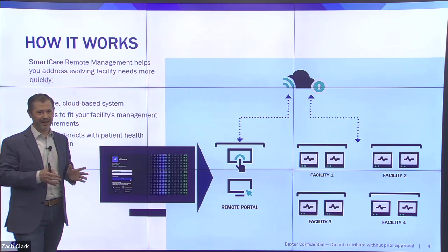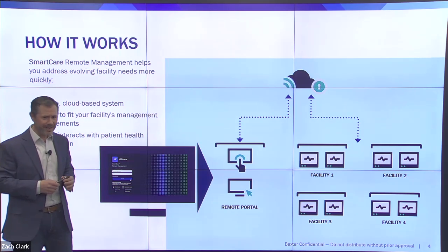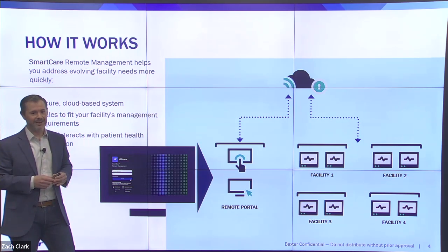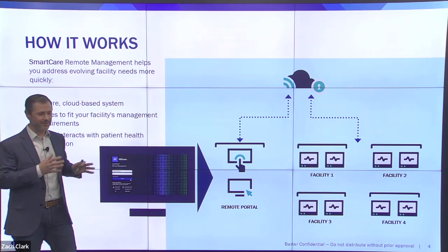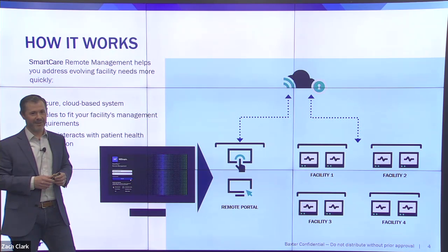This is purely service-only data. We want to be really clear about that because I know that's a question that gets commonly asked as far as the risk of PHI exposure. This platform does not interact with PHI. It's a very common and really important question to make sure that we clarify.